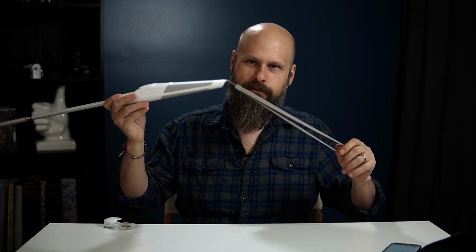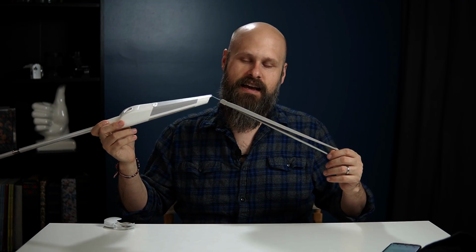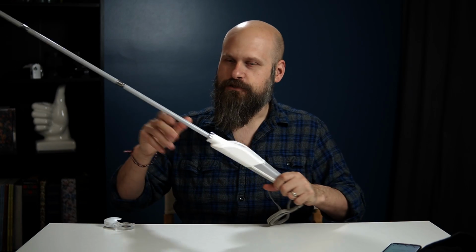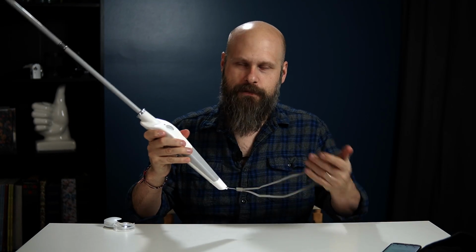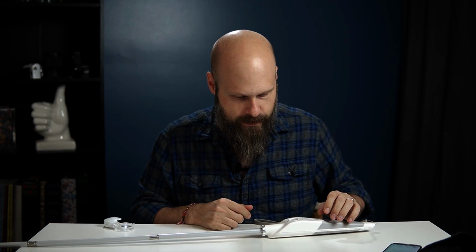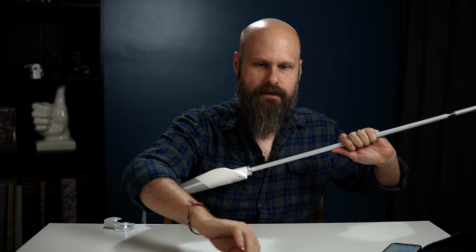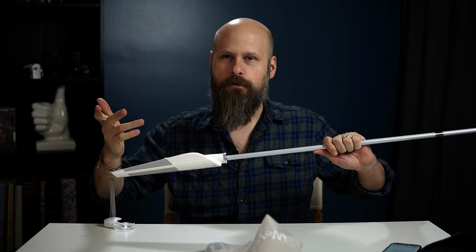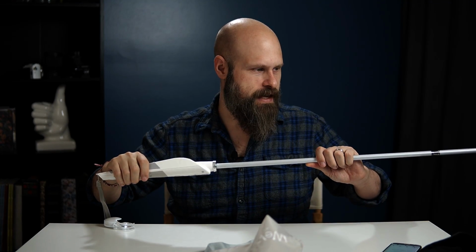The wrist strap is very stretchy. That's nice, but also might be a bit of a negative. It's not like a traditional cane where you fold it up and you wrap the strap around it to hold it closed. You could theoretically tie a knot in this strap at the end to make a small loop that you could wrap around it. You could do that, but that's what the bag is for also. Although, I don't know if I'd want to carry the bag around with me everywhere just for when I close up the cane.